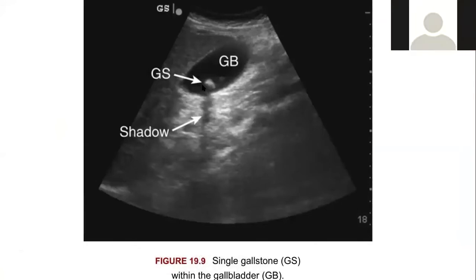I don't think we're gonna have to look for sludge. I've seen it somewhere before. Anyways, where's the fundus here? And where's the neck? I don't know, man.